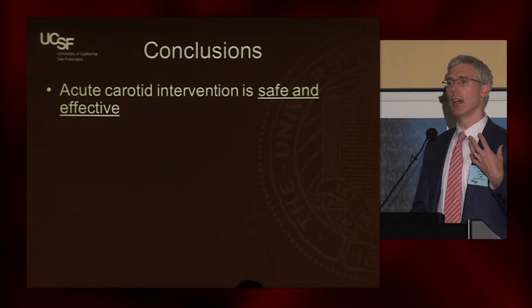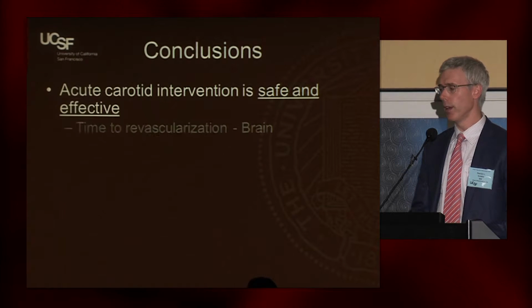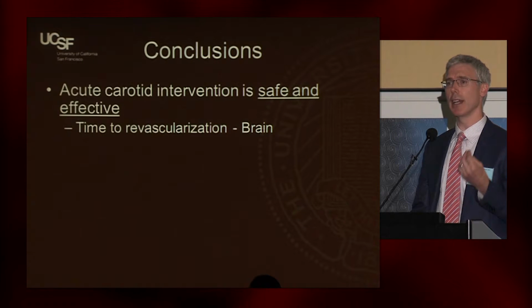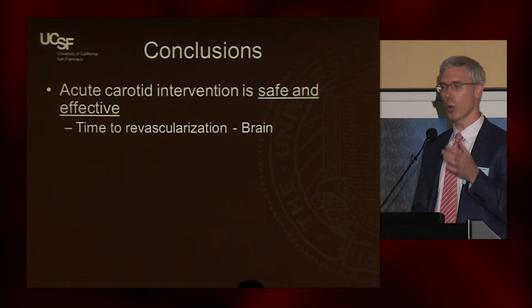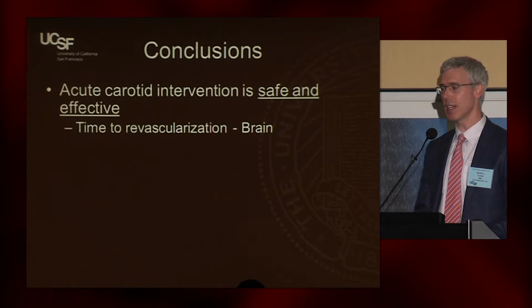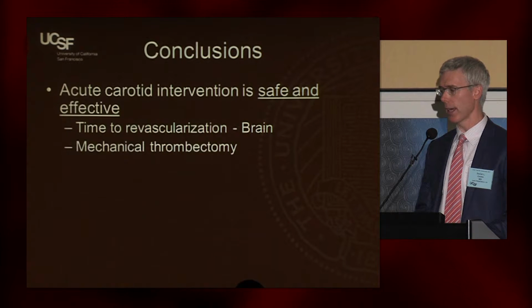So in conclusion, intervention in this setting is safe and effective and should be performed. But the most important part, again, is you really need to focus on revascularizing the end organ. At least in our practice, as much as the neck is clearly an issue to get to the head, we most reliably can get through those occlusions safely, and that allows us to deal with the brain first, and then we go back and down and deal with the neck.